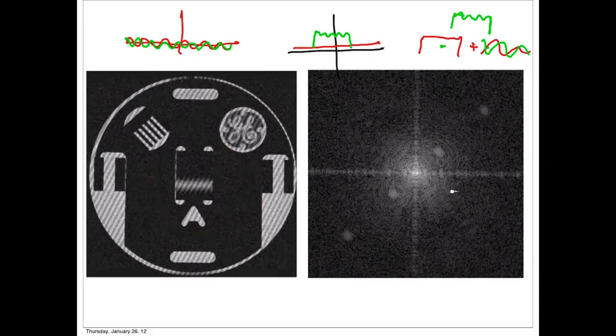It happens a lot in MRI, particularly when you do EPI. So is there a fairly straightforward way to correct for that sort of spike? Like, can you average pixels in the Fourier space in order to totally eliminate that ripple? Yeah, totally, you can do it. Absolutely. That's actually how it's done. Sometimes the scanners will have spike detectors, and then they'll just interpolate. If they detect a spike, then they actually would remove a lot of them. It's not perfect, but it definitely corrects this really bad artifact.